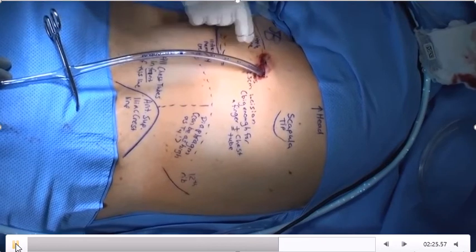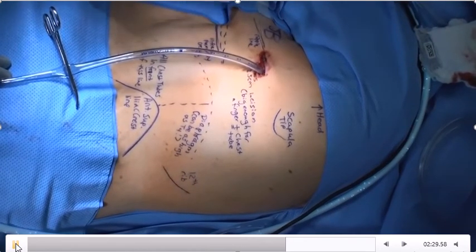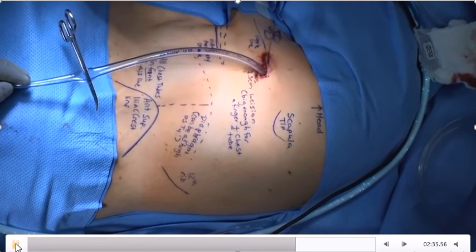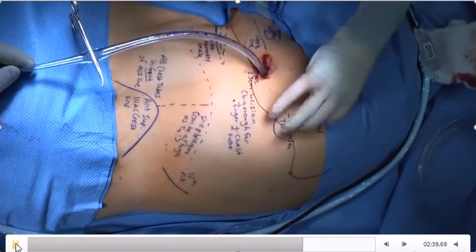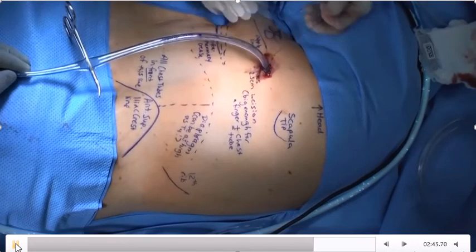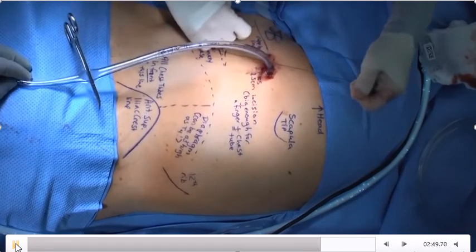He also can have more than one suture in order to make more secure fixation of the tube. He is now going around the tube multiple times, going back and forth in order to make good fixation with this chest tube.